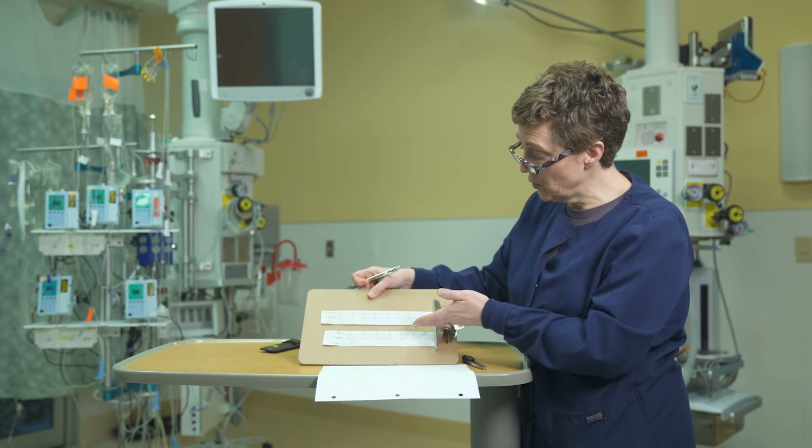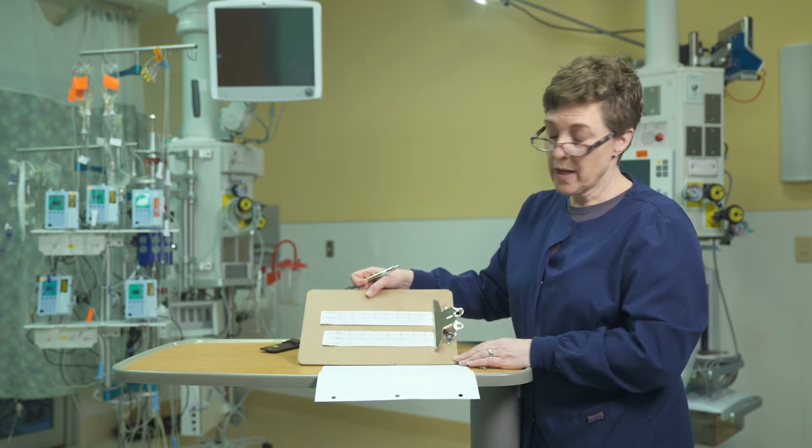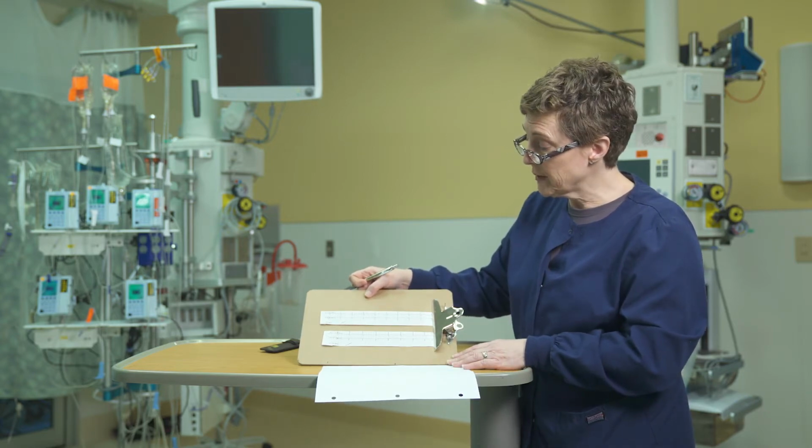In fact, if you want to, you could even fold up the bottom of your strip and make your little marks on there. And that's the basics of rhythm interpretation. Now you should be able to get started using the material from your textbook and the practice strips that you have. Good luck.